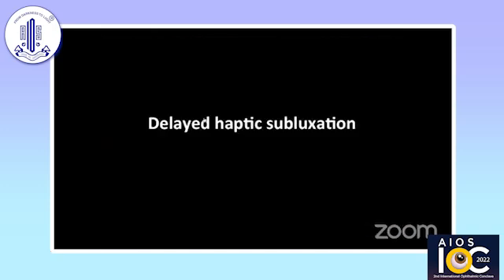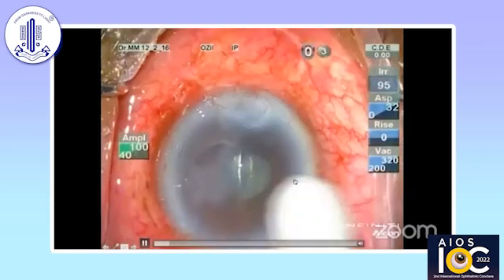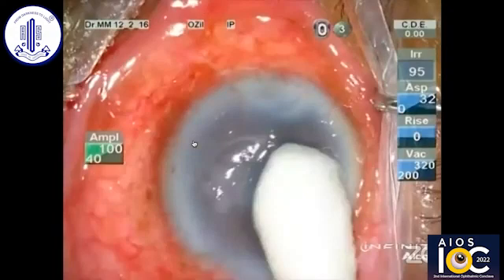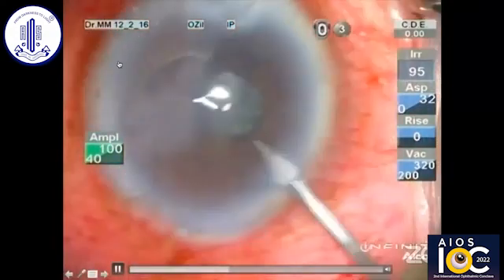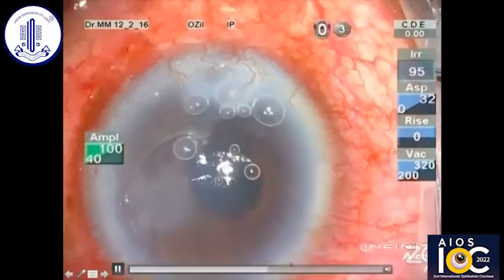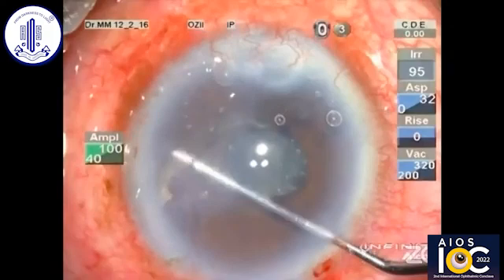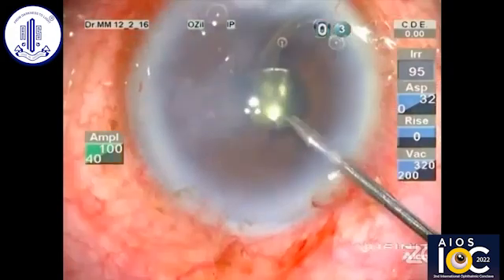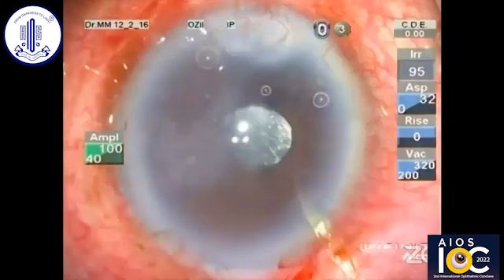I have encountered one or two cases like this — one referred from Maldives. The lens was very well centered and fibrosed within the bag, but the whole haptic was out in the anterior chamber and part of it was stuck to the endothelium. The haptic is causing the endothelial damage but the lens is very well stuck. In cases with single-piece lenses where one haptic is in the sulcus but the lens is fully fibrosed in the bag and well centered, you can leave the IOL inside the bag and take out only the haptic, then wait for the cornea to clear or proceed with a corneal procedure later.